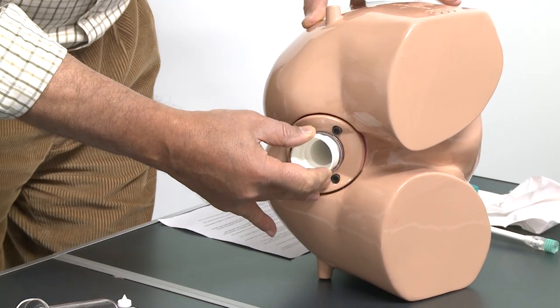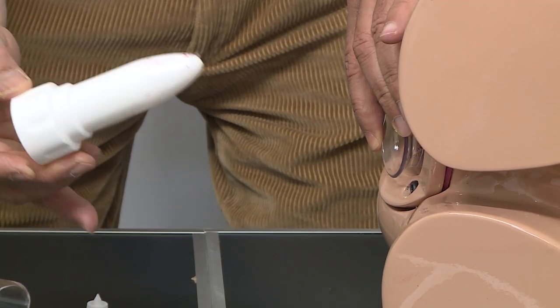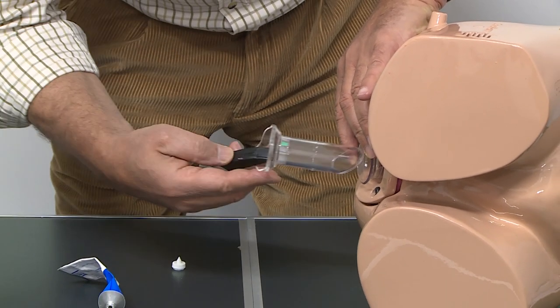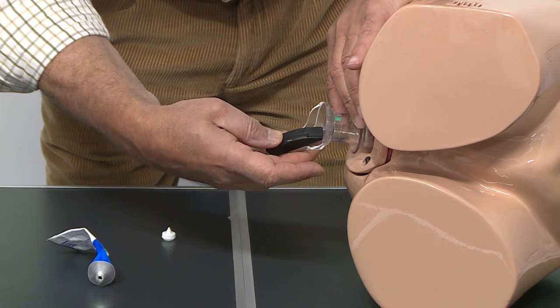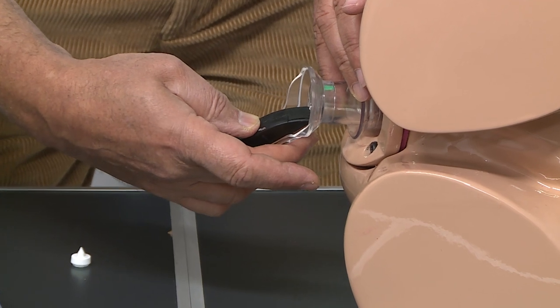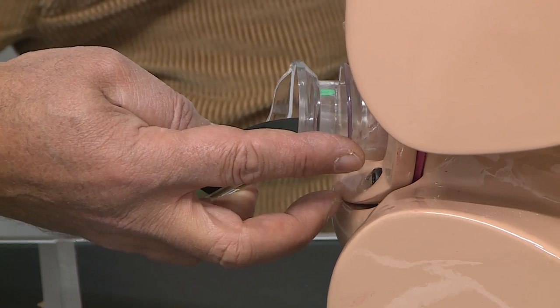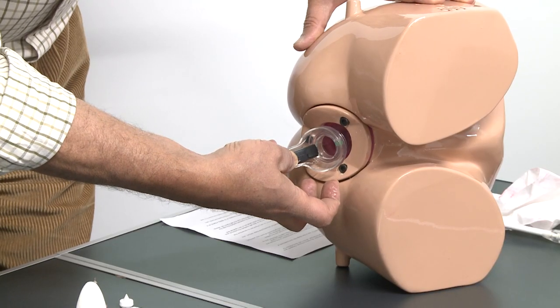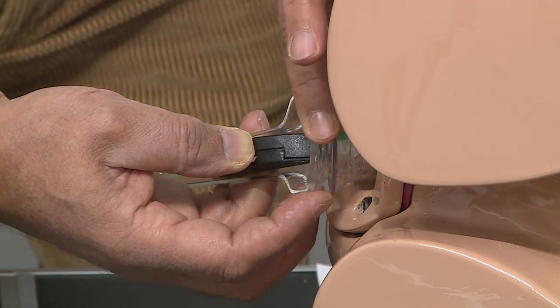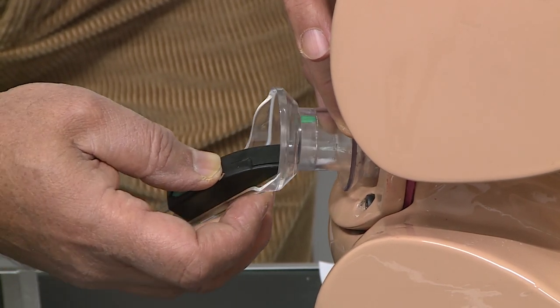After insertion, we hold the sleeve and take the trocar out, then introduce the body of the scope. There is a locking mechanism which is very helpful in holding the scope inside the sleeve. If we want to remove it, we can simply twist it to unlock.